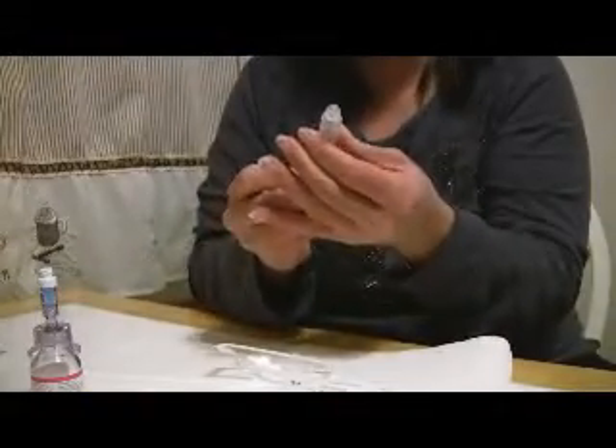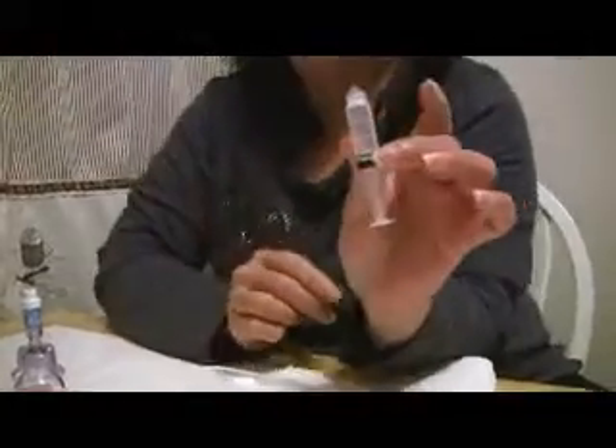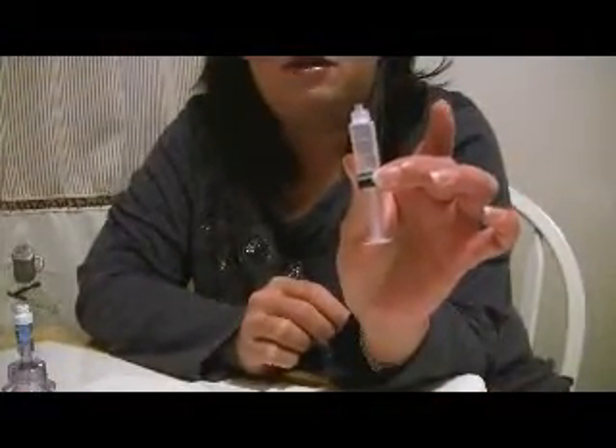My dosage is to fill the syringe completely up to the three milliliter mark. Everyone's dosage is different, but you would draw it back to whatever your dosing line is.